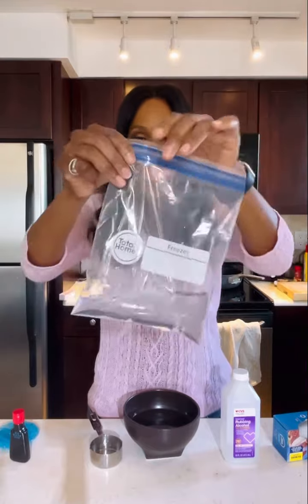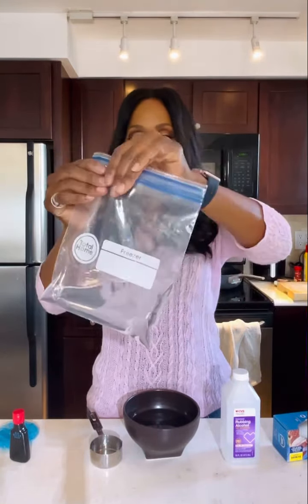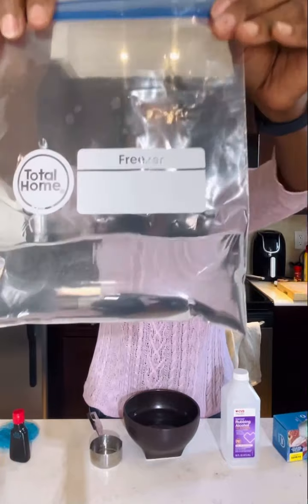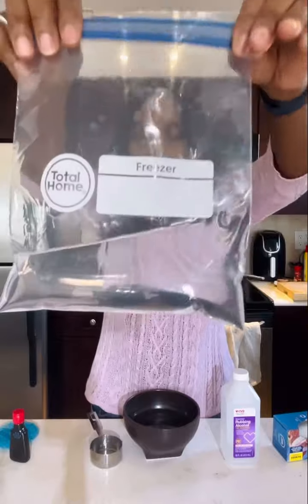And actually, guys, you know what I should do? Try to get the air out. So once you put it in there, try to get enough of the air out, okay? If you take a look here, if you guys can see, the liquid almost looks like liquid gel already. It kind of looks like gel, but in the liquid form, which is super cool, all right? But we're not done because we want to make it fun, right? That rhymed.